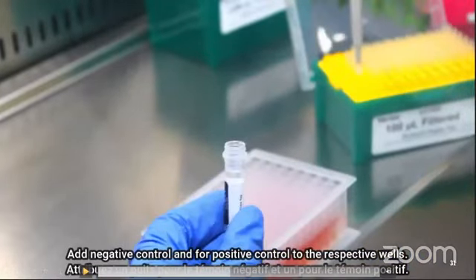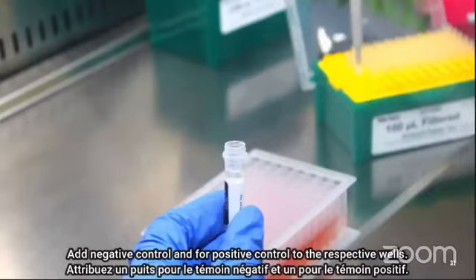This negative control is RNase free water, and we use RNase free water as a negative control, and we need to extract out this negative control as a sample, and we call it the extraction negative control.